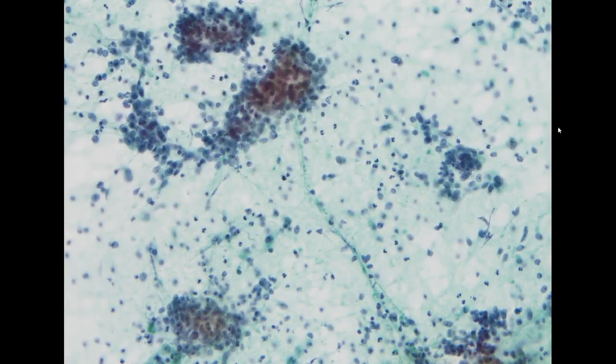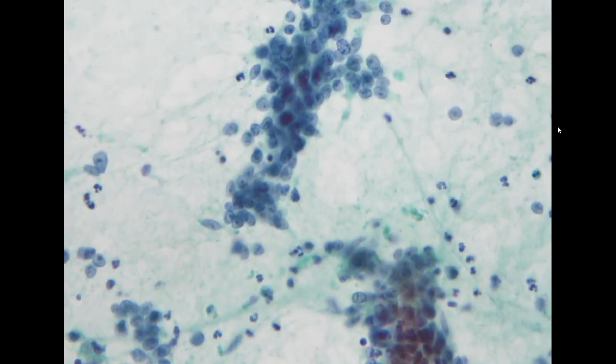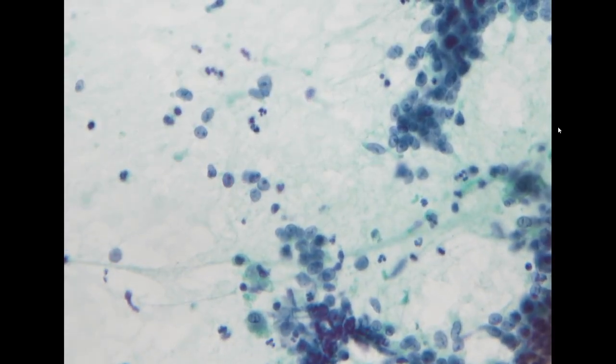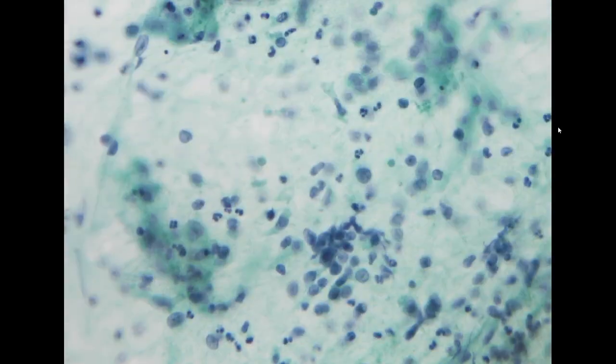For the direct smear, again, we see large chunks of overlapping cellular fragments, and the nuclear atypia is obvious. There are quite a few naked nuclei adjacent. So it is likely a myoepithelial tumor, but we cannot exclude some ductal differentiation as well.